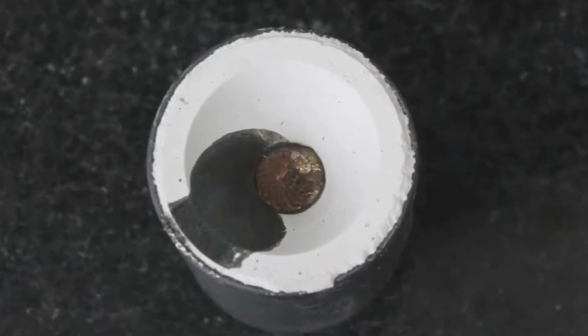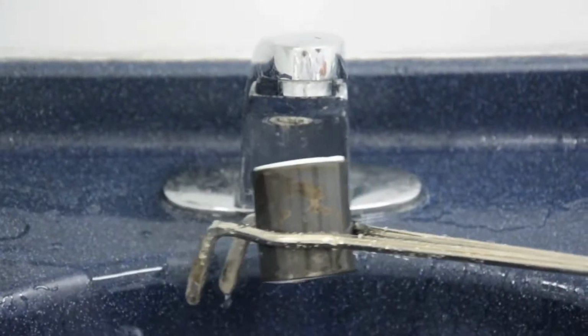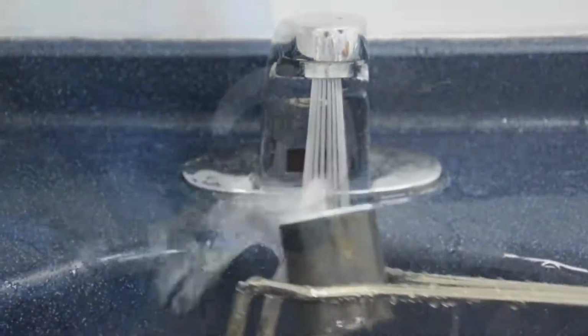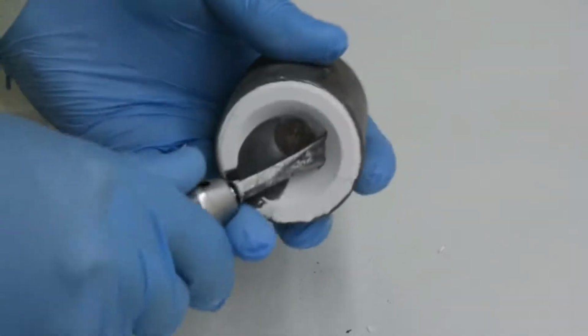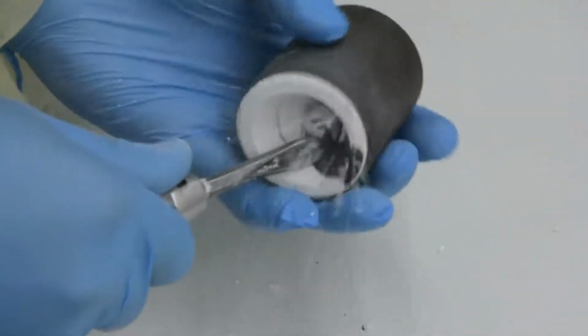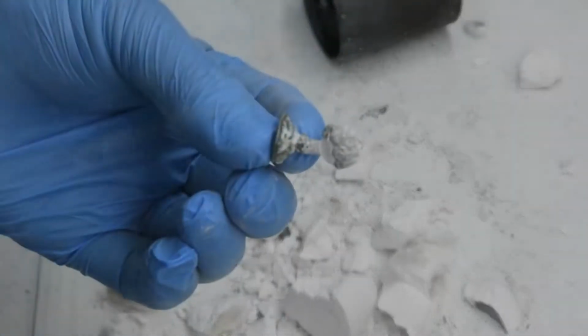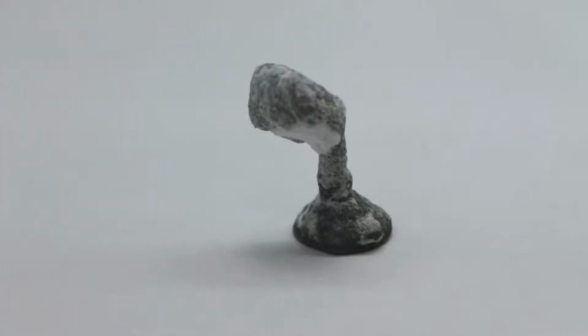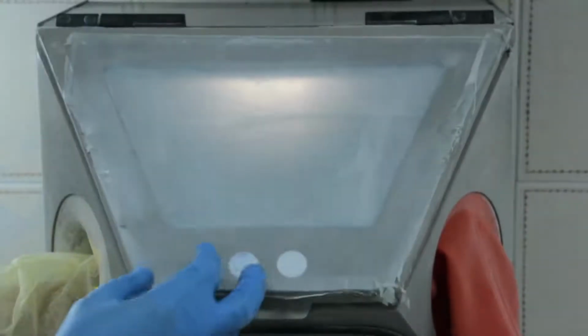After the red glow has disappeared from the bottom, the casting ring is plunged under running cold water. Trimming is done from the bottom end of the ring. The casting should appear smooth with a dull dark oxide layer. The oxide layer and other remaining particles of the investment should be removed by lightly air abrading all the surfaces.